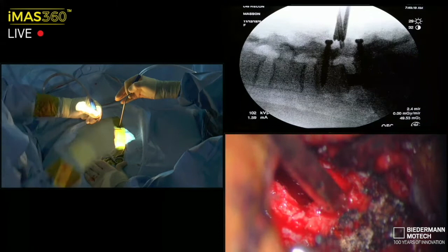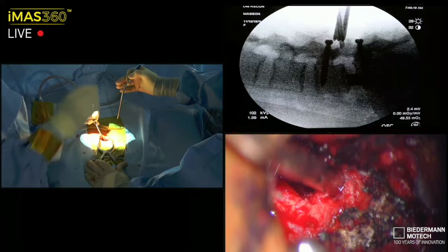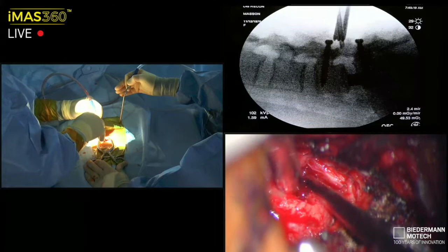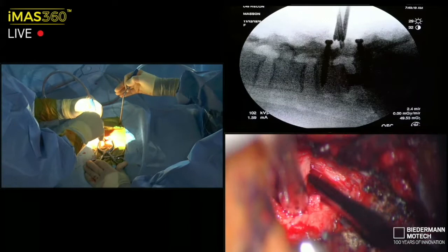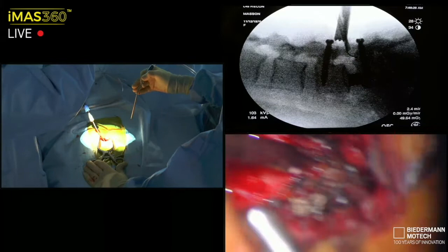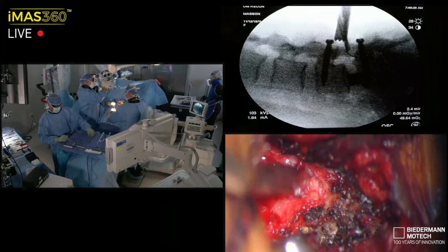Okay, I want to be careful there. It feels pretty tight at the lateral thecal sac margin to the right-sided ligament. Let me have Murphy. There's dura on the right side. This is all hypertrophic ligament here on the right side. I'll go lateral fluoro. You can see where I am. That's right side. That's over the top of the dural margin right here. So we're making good progress relative to left-right exposure. I'm going to get a little bit more low.